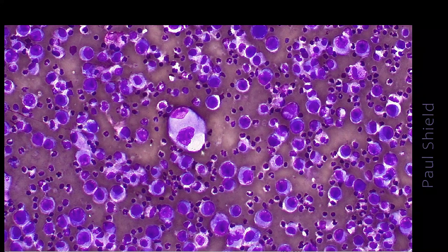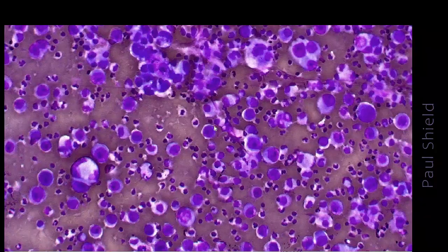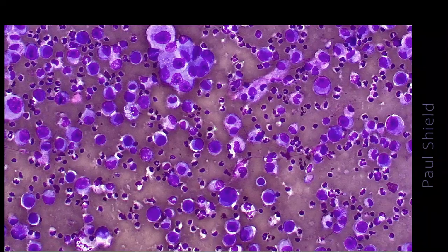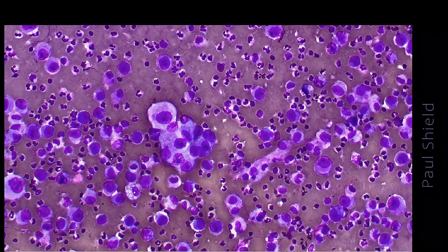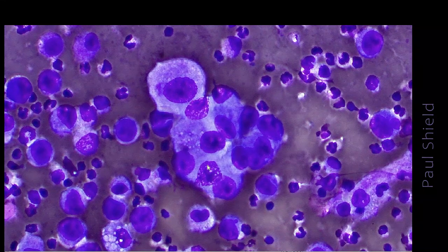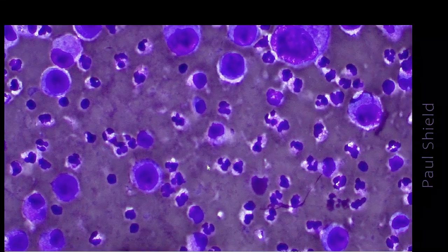And this group are quite suspicious, so that big clear area is probably a vacuole, really large nuclei, and so that degree of atypia is not normally seen in reactive mesothelial cells, or the vacuolation. So I'll be quite interested to see how the PAP slide looks in this case. That's probably going to be quite helpful. Another group of cells there, so I'm thinking this is adenocarcinoma. And this group is certainly looking glandular. See how the nuclei are arranged around the outside down the bottom there?